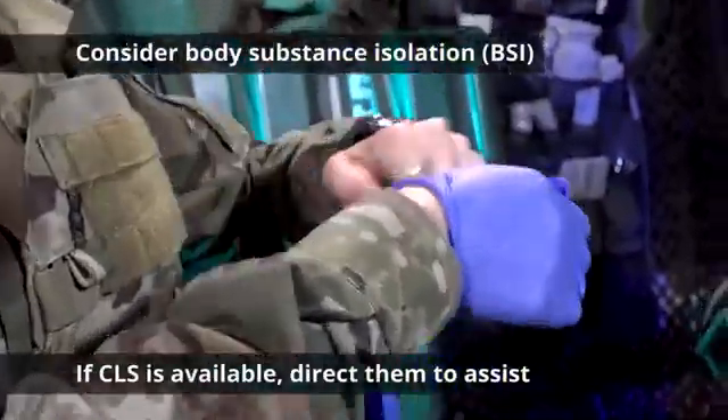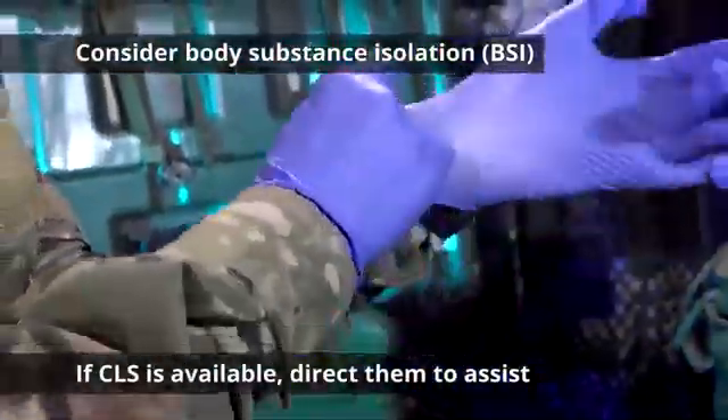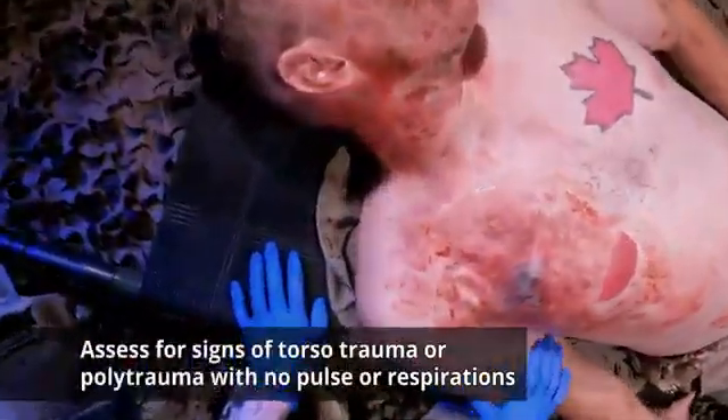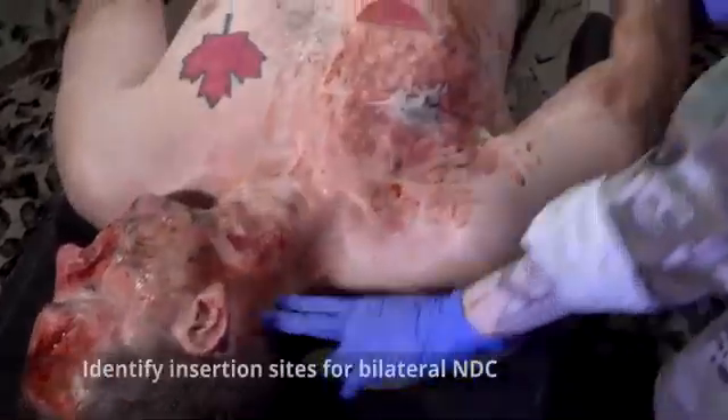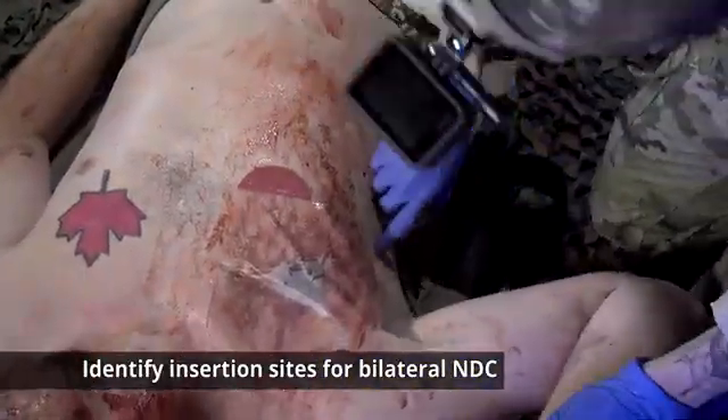Consider body substance isolation. If a combat lifesaver is available, direct them to assist. Assess the casualty for signs of torso trauma or polytrauma with no pulse or respirations. Next, identify the insertion sites for bilateral NDC.